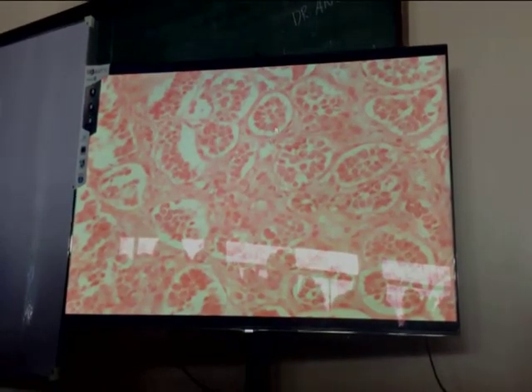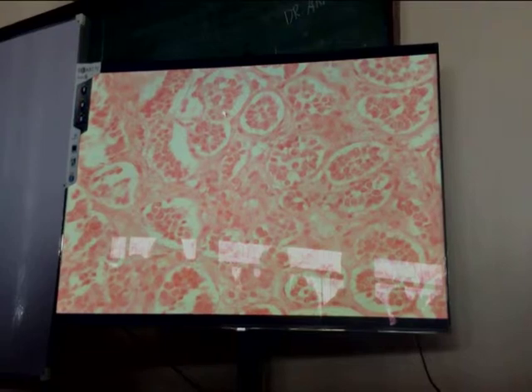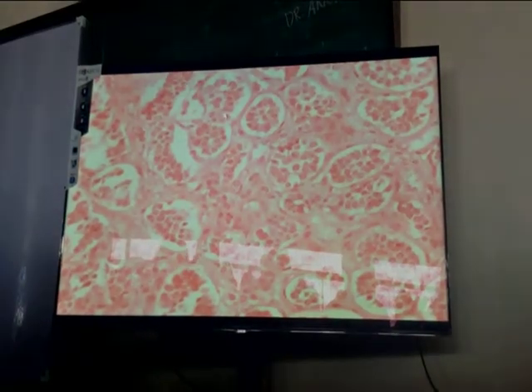It is composed of uniformly sized tumor cells with eosinophilic cytoplasm. Sometimes those cells are capable of secreting hormones. Carcinoid. So just memorize that typical appearance of carcinoid.